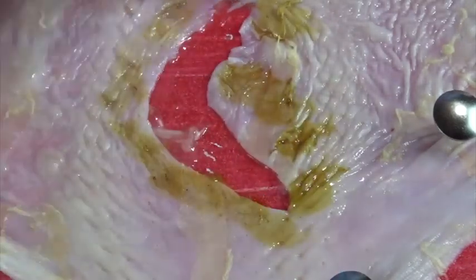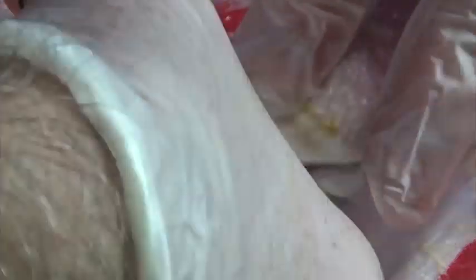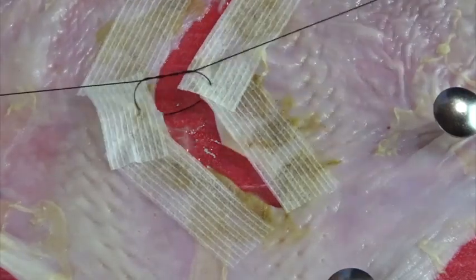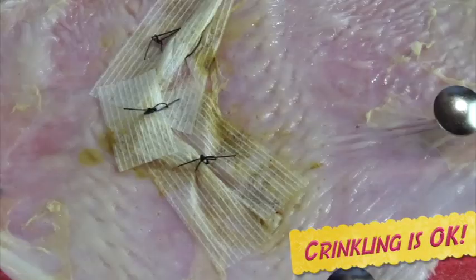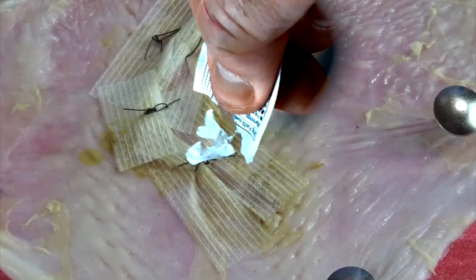If you apply some benzoin and steristrips to the wound margins, you can then suture through the steristrips and the skin together. The steristrip provides enough support so you can put tension on the suture without ripping through the skin. The steristrips simply stay in place until the sutures are removed about 10 days later. One advantage of this over tissue glues is that the patient can put antibiotic ointment on the wound without weakening their repair. Just have them put it right over the suture so it can track through the holes in the steristrips to reach the wound.